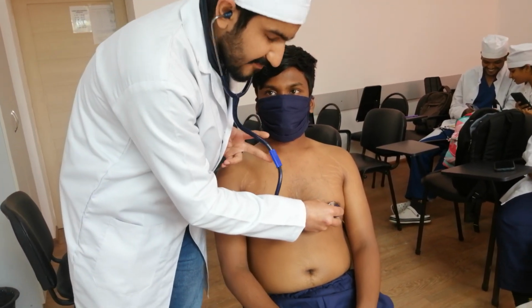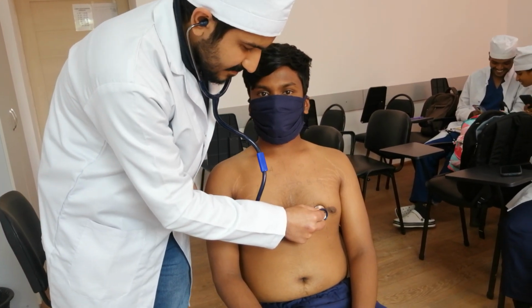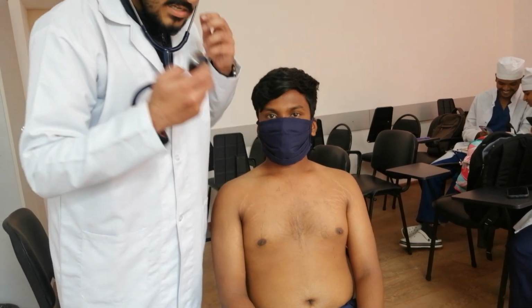1.5 centimeter inside. You're listening something? Second point is aortic valve, which is located on the right side, second intercostal space, mid-clavicular line towards parasternal line.